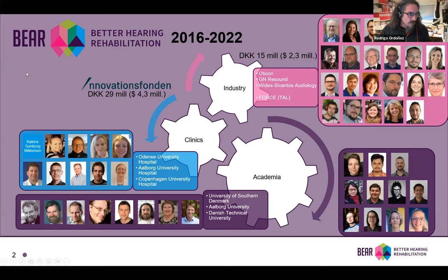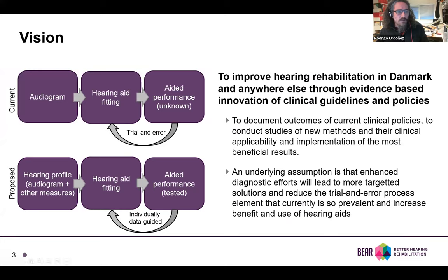The project was funded by the Innovation Fund and supported also by industry, and it involved clinics here in Denmark, Oticon, GN Resound, Widex, Sivantos, Audiology, and FORCE from the industry, and three of the universities here in Denmark. So it was a very broad collaboration that involved most of the relevant people within hearing aid fitting and development. The main vision of the project is to improve hearing rehabilitation in Denmark and anywhere else through evidence-based innovation of clinical guidelines and policies.